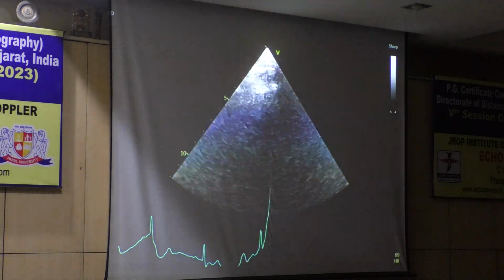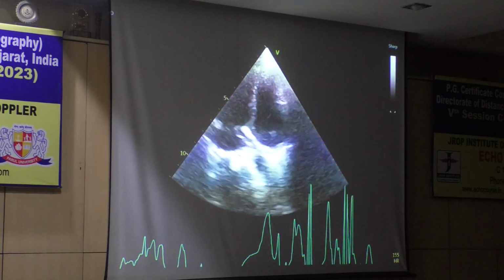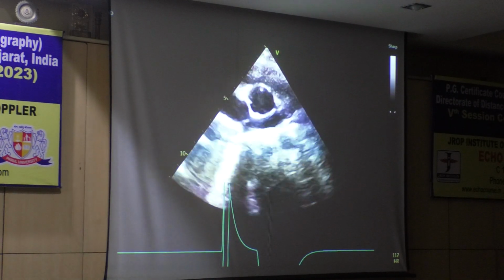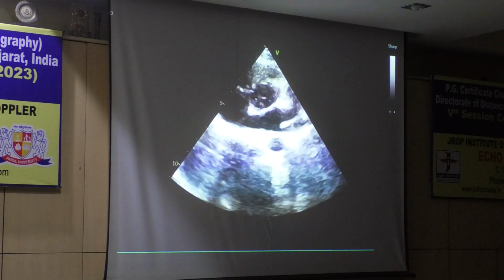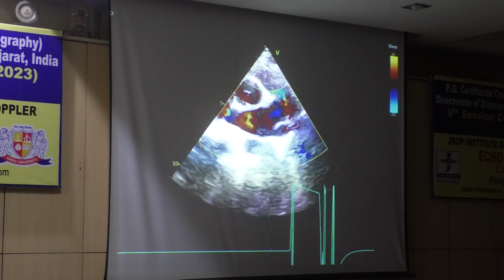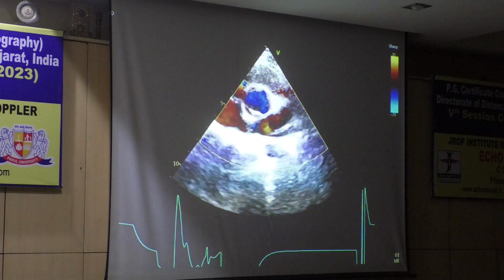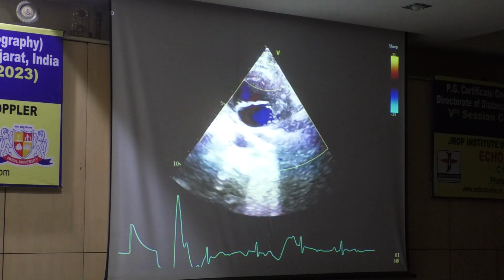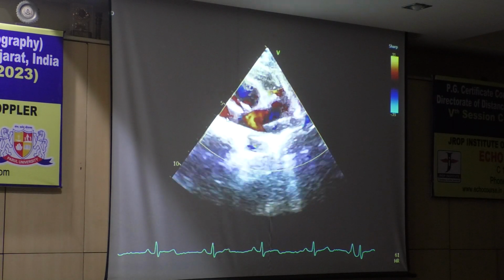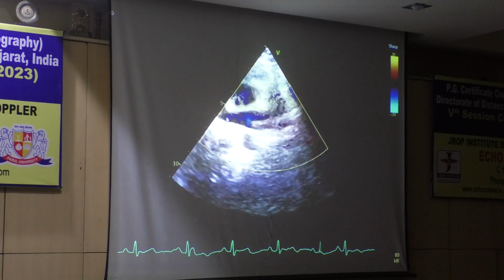Slightly bigger child. Sometimes you have to go high parasternal. So she has tight clothes. Yeah, okay. So I think we will show you some other smaller case with better windows, but you can see the left lower vein here, and can you see the right side vein here? Yeah, this is the right side vein. Again, right upper, right lower, and I'm seeing the flow of the left upper pulmonary vein, but not very clearly. But this is the left upper pulmonary vein in between.